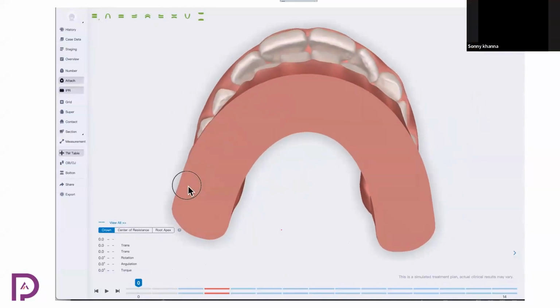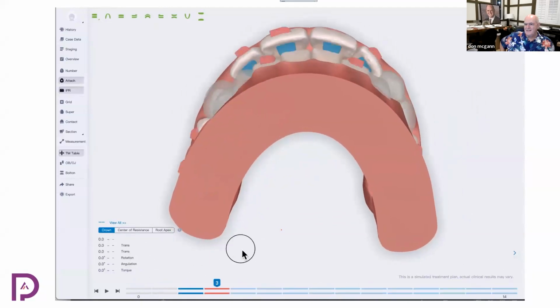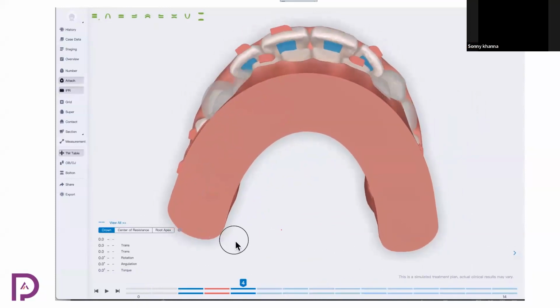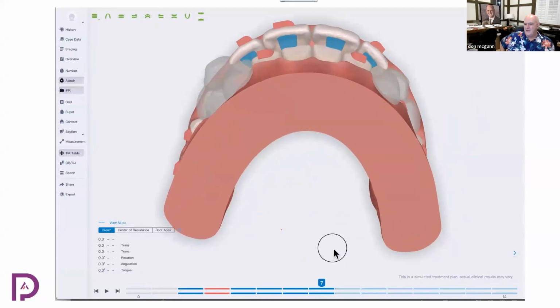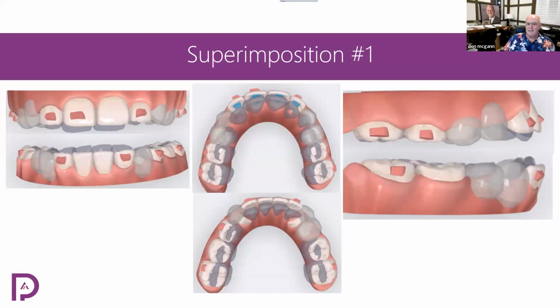And then the overjet. Remember, growing patient. Leave a little extra overjet. Don't get it real tight. You can tighten it down in phase 2. Just don't do it right now. So here's our superimposition. So you can see the incisors are advancing. You saw them go forward, upper and lower, right? And in such a case, you could decide that's too protrusive at the start of phase 2, and then decide to extract bicuspids. If you do, then you change the brackets. Okay.